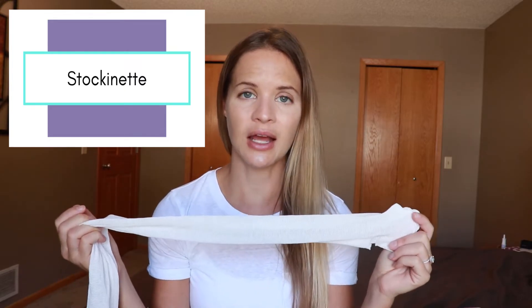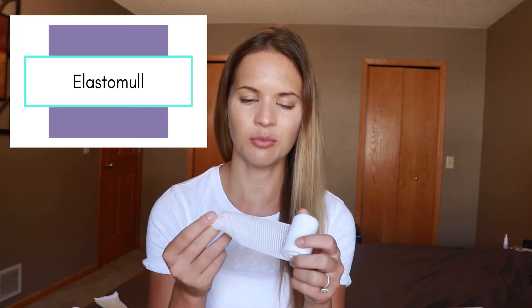The first thing I'm going to be using is stockinette, which will be used as a liner that goes against the skin. For the hands, we'll use Elastomull, which comes in a two-inch width roll. You can fold it in half and roll it back up to create a one-inch double-layered roll. That gives a little bit better compression to the fingers and is more comfortable and easier to use.